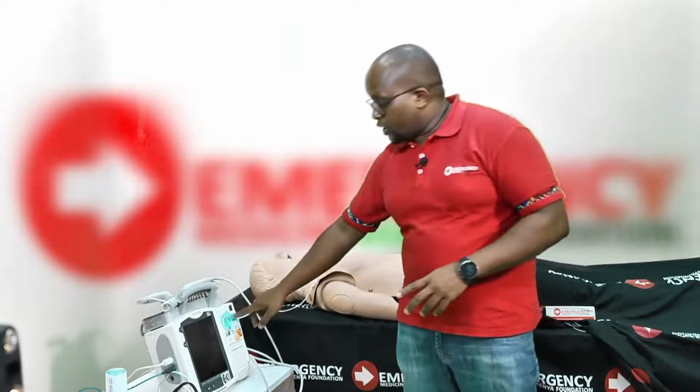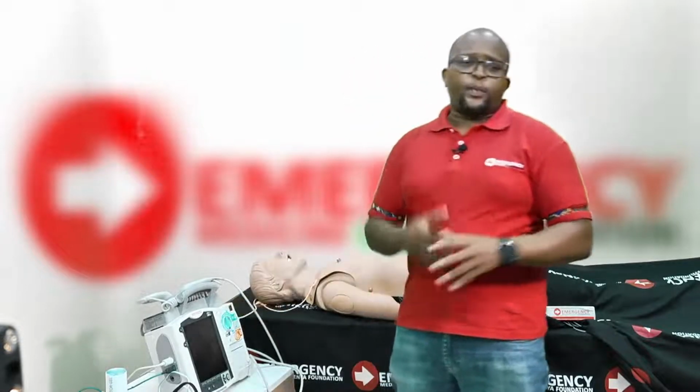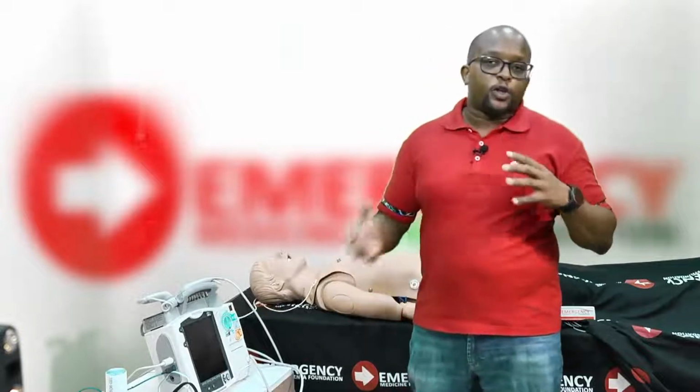That's the first shock energy you're going to use. Subsequently, depending on your manufacturer, some recommend you escalate, others recommend you remain at the same shock, so you need to know your manufacturer's recommendations.